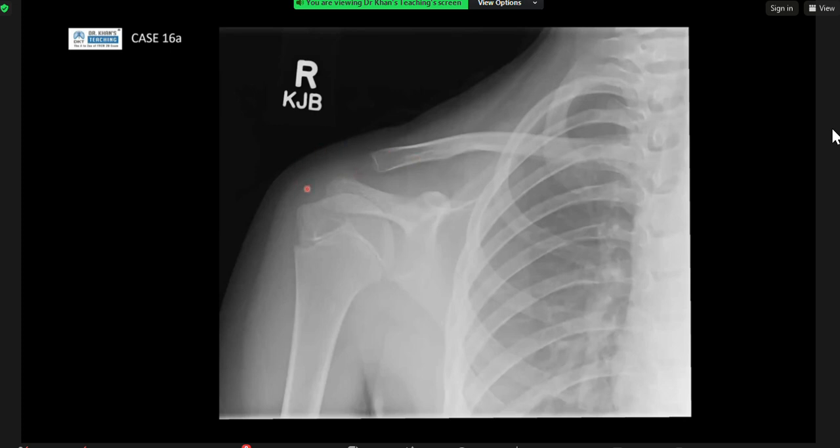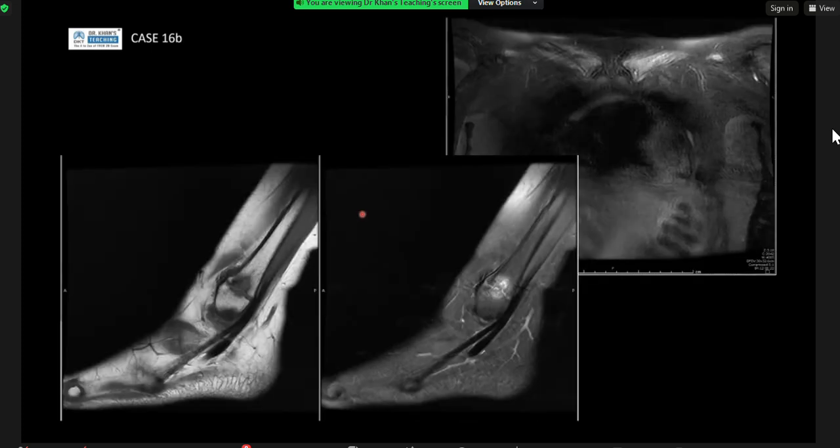Okay, but then MRI will help you clarify it, but just remember your acromion ossification, actually I don't think it starts to form until you're about your 20s or early 20s or late teens. It's why you never see the acromion. Right.